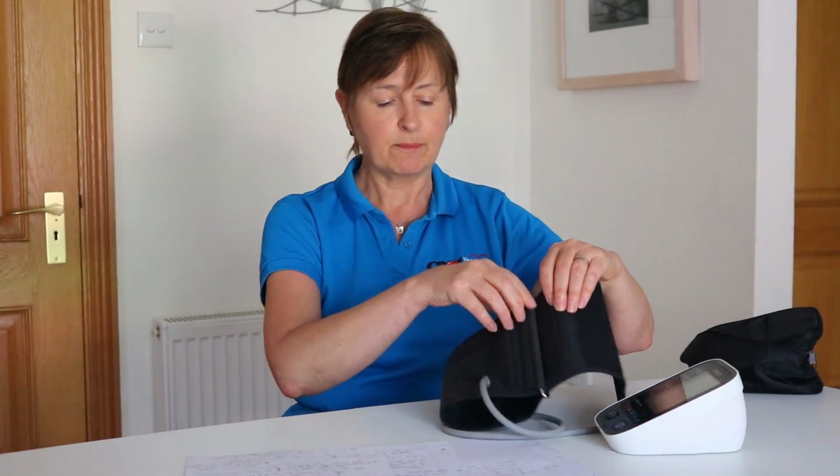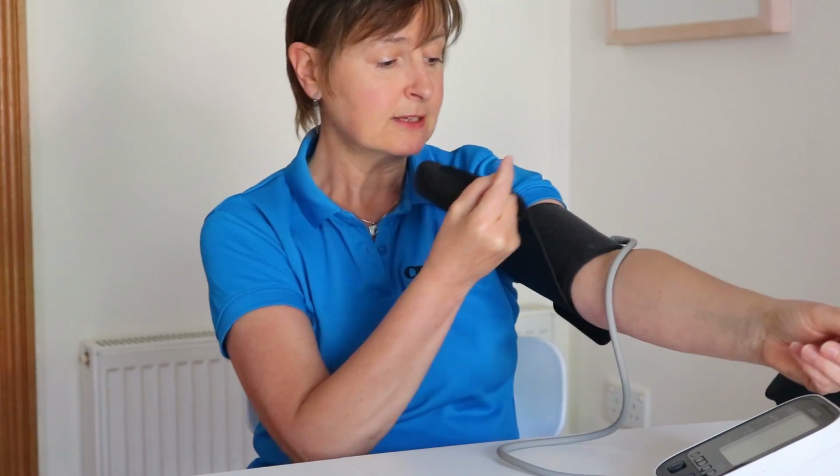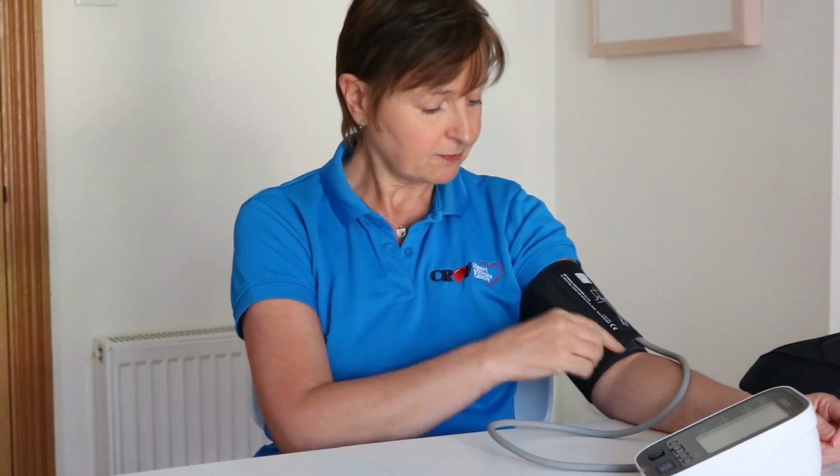It's important to wear short sleeves, or at least have the sleeves loose so that they can be raised up, because you need to put the cuff onto your bare arm. Put it on, and the correct size as well. Make sure it's nice and comfortable. It should be on the upper arm, about the level of your heart, and just above the bend of your elbow here. Then you need to sit back in the chair and just relax while you're doing it, because you shouldn't really talk or be active when this is measuring.